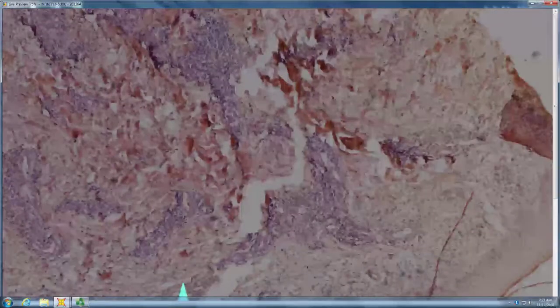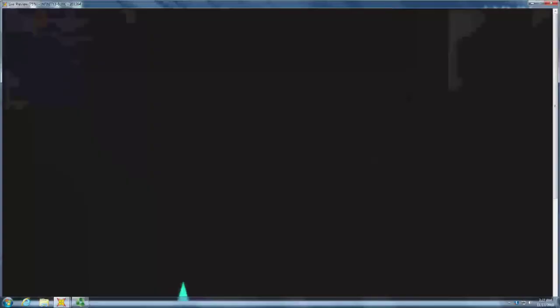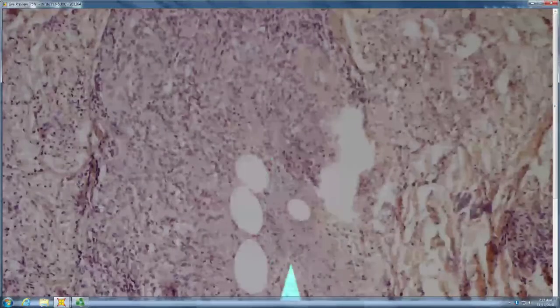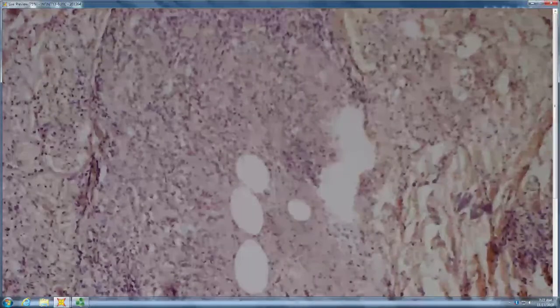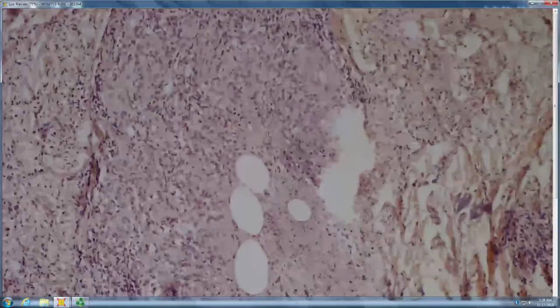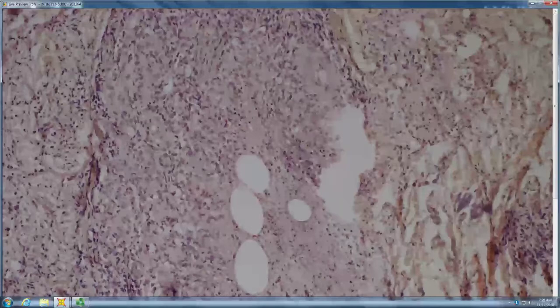So you have inflammation in the dermis, nodules maybe, and you have more of a lobular panniculitis. And what do you have? Neutrophils and caseous necrosis. So with granuloma, neutrophils, and caseous necrosis in the fat, what do you have to think of? Erythema induratum, which is what this patient had.